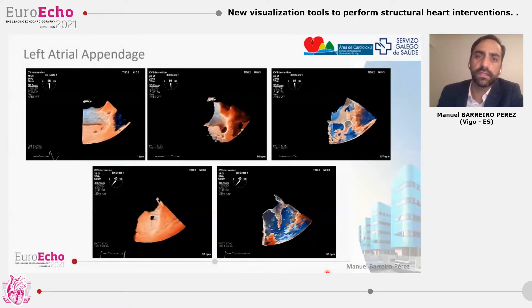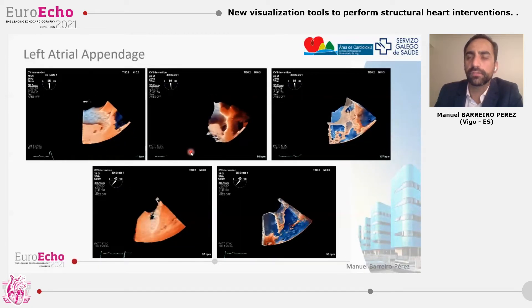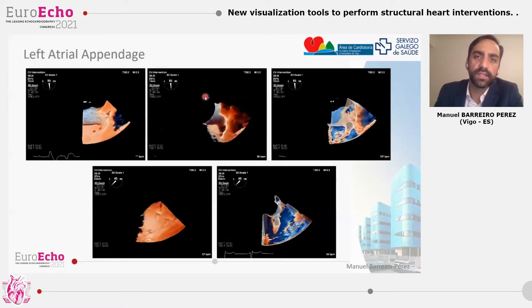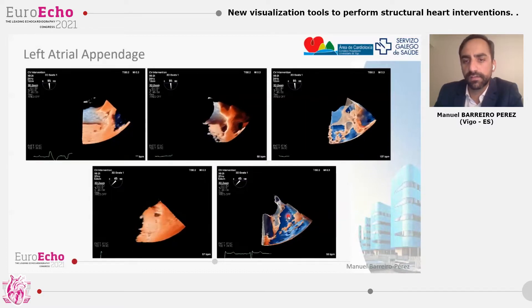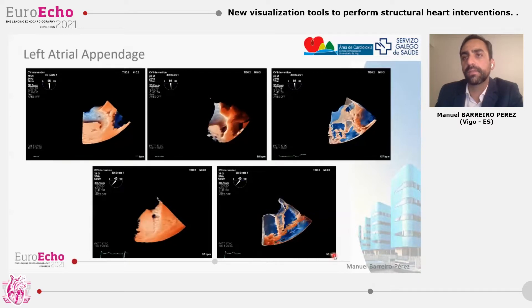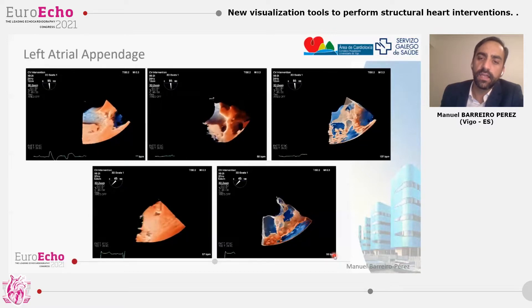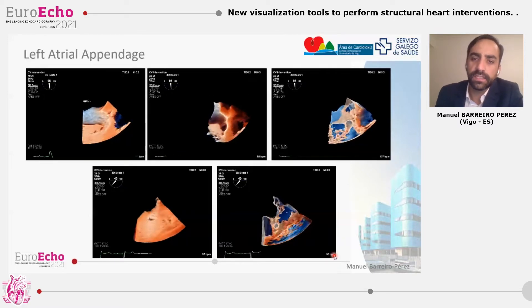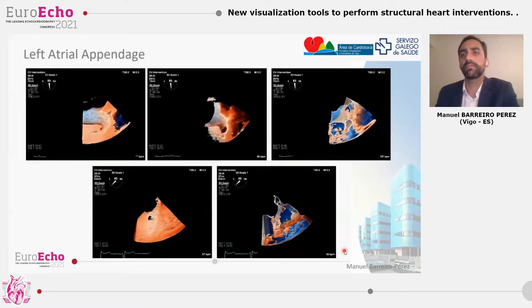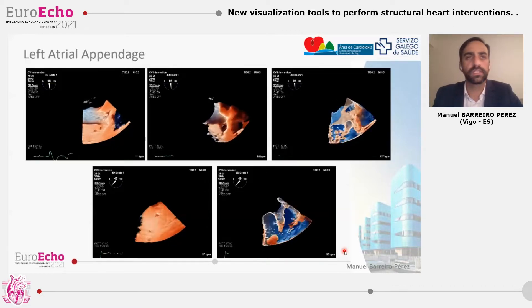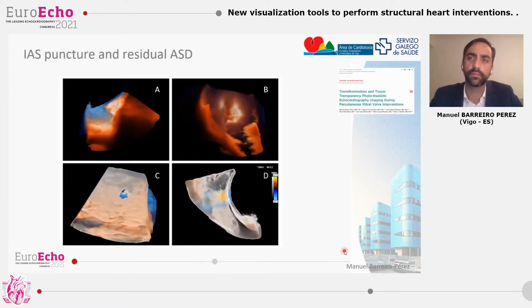Regarding the left atrial appendage, we could study the inner volume of the left atrial appendage to exclude any clot or thrombus, with the lights moving into different positions. If we use the glass view, we have an external point of view — a view more similar to what we see when using CT for assessment of the left atrial appendage. This is really useful for studying the real anatomy, excluding any lobe, and for planning and device selection in this procedure.